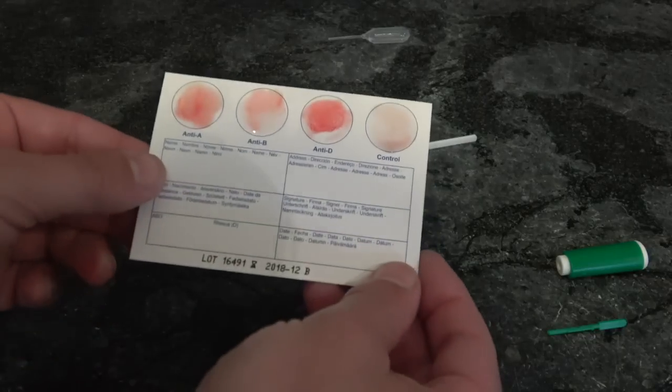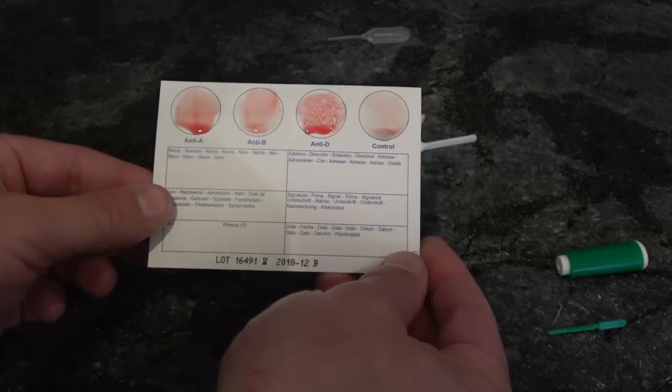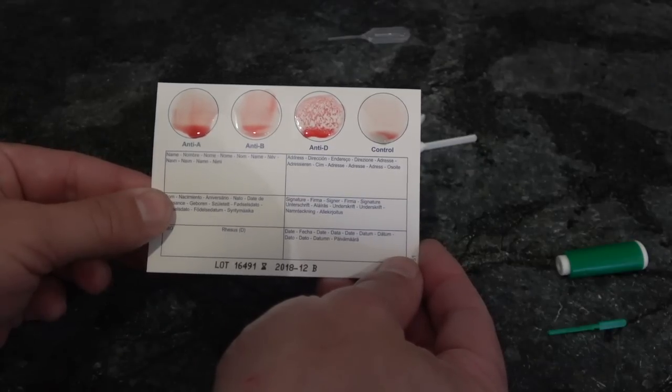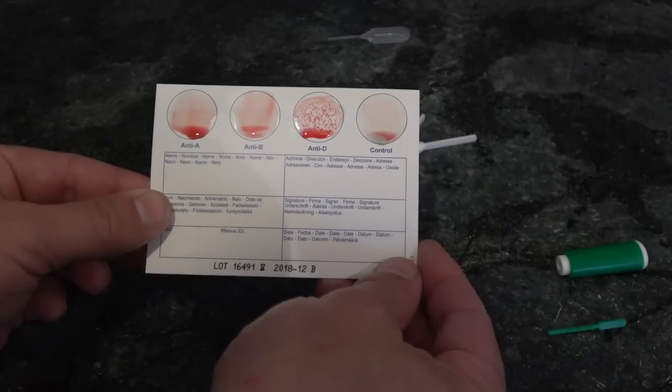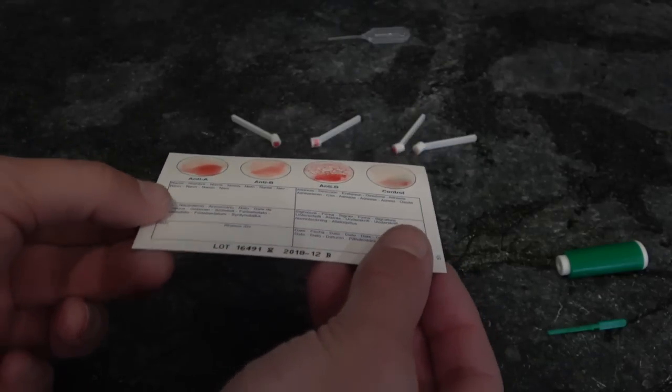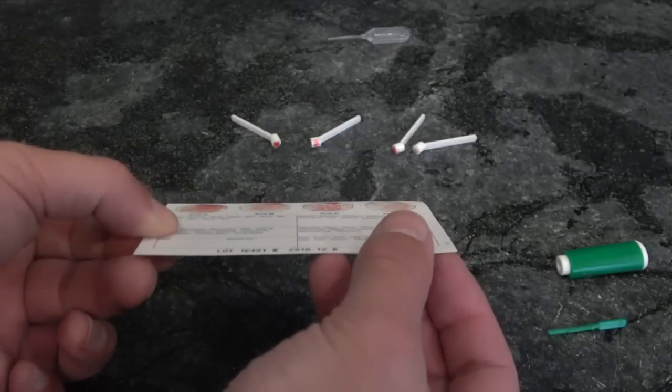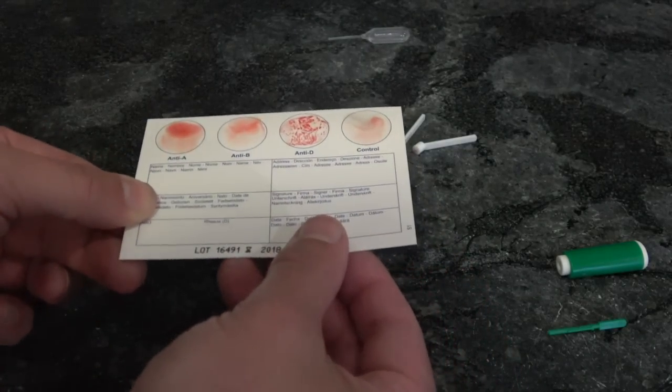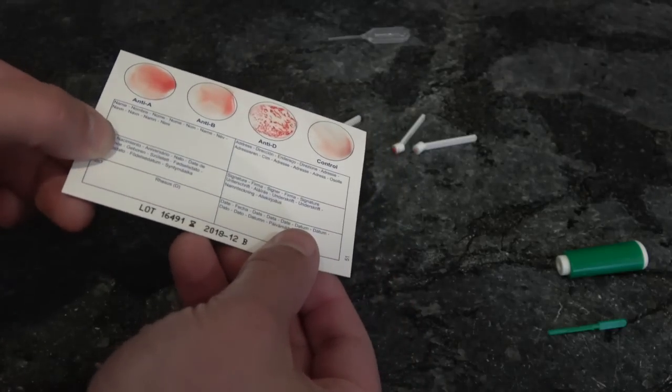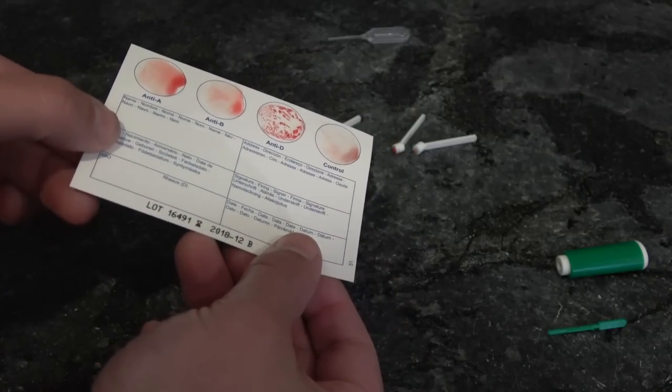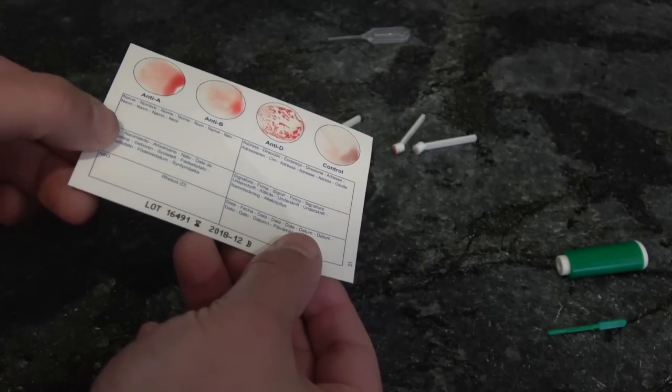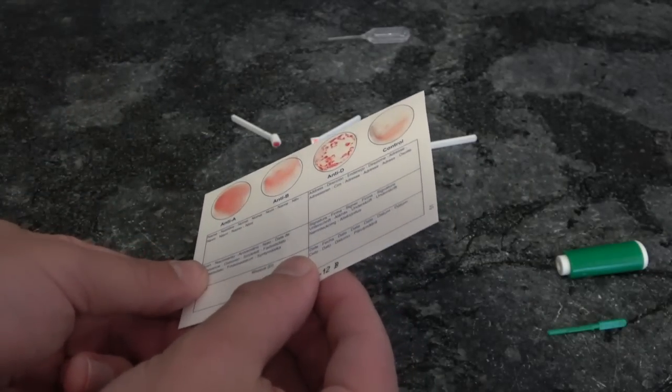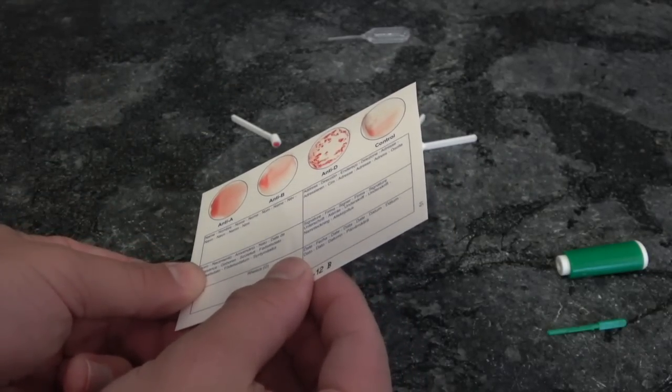So now we're going to take the card and we're going to tilt it down for about ten seconds. You could already see the anti-D agglutinating there. And we're going to turn it, rotate it away. Just tilt it away, center it again, then tilt it to the right. You're trying to keep the drips from dripping out of one circle and into another that would contaminate it, and then drip to the left, just like that.